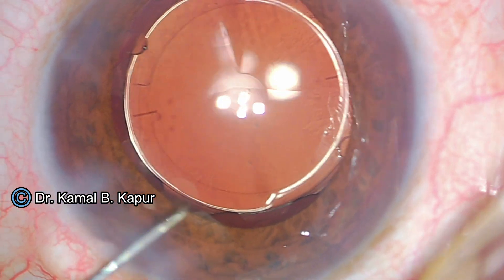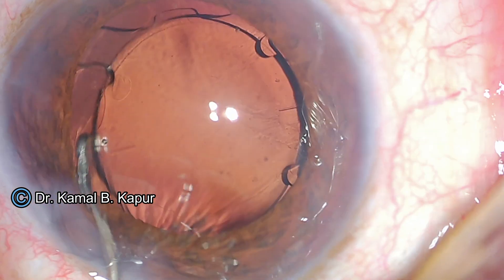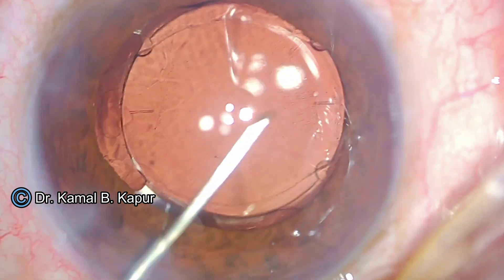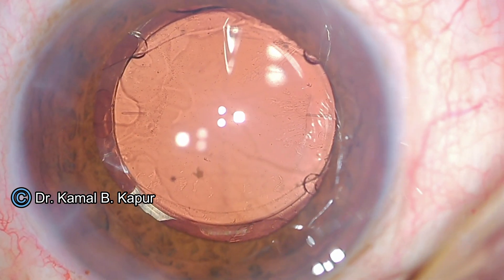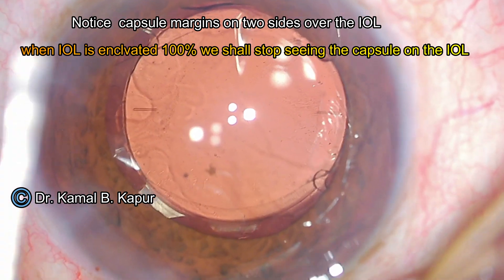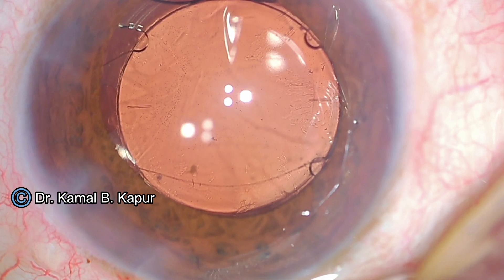Viscoelastic has been instilled. Now you can use the Sinskey and pull the anterior notch of one side. Align it well with the capsulorhexis nub. Make sure you pull the second nub over the capsulorhexis margin and align it with the nub. You have to be very careful because once these anterior notches have been placed over the capsulorhexis margin, you will stop seeing the IntelliAxis nubs. So, just before you pull them out and lock them, make sure that the alignment of the toric lens exactly matches the toric axis of the lens and the IntelliAxis nubs. Having locked these two bigger notches, now go on to locking the lateral notches of the Femtis toric IOL.